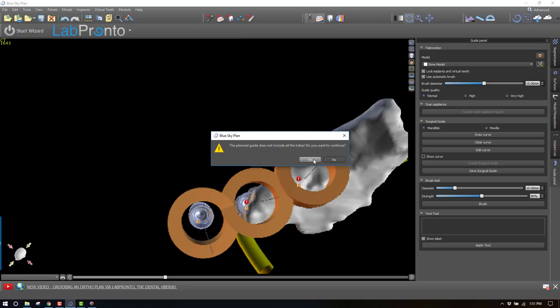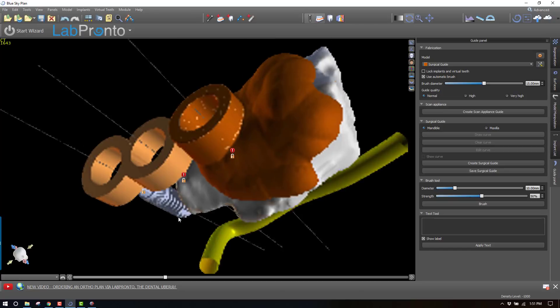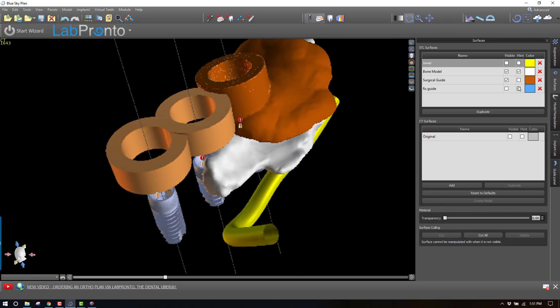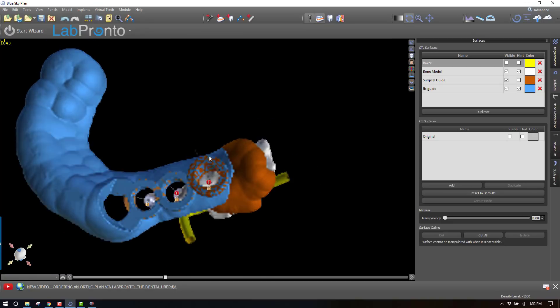It says you don't include all the tubes — I do want to continue because we've already got one guide that includes all the tubes, so I'm not terribly concerned about that. Here is the resulting guide. If you need to, you can trim that up a little bit with your cut tool. Now let's look at what we've got: the lower model, the bone supported guide right here — that's going to be our bony stop — and here is this surgical guide.